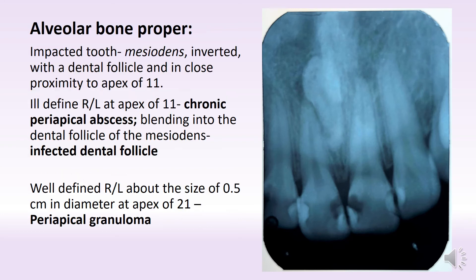The alveolar bone proper — what do we see? First of all, it is important to note that the mesiodents, which is inverted, is inside the bone. So this is an unerupted or impacted tooth.